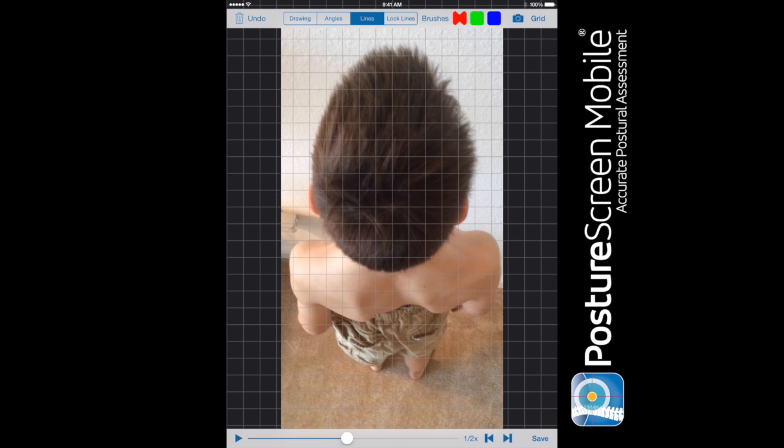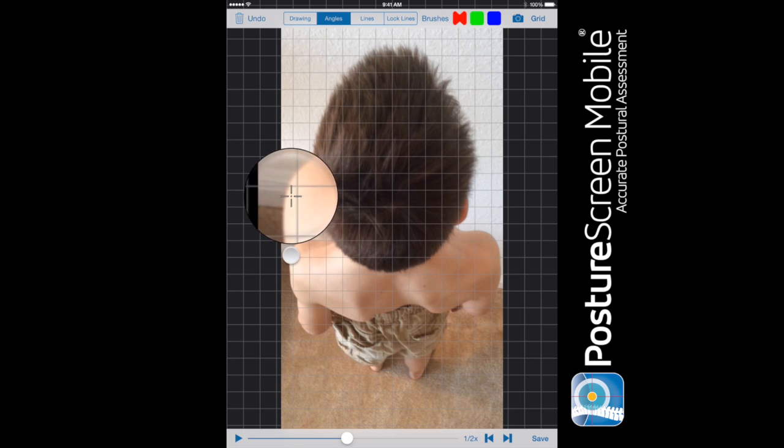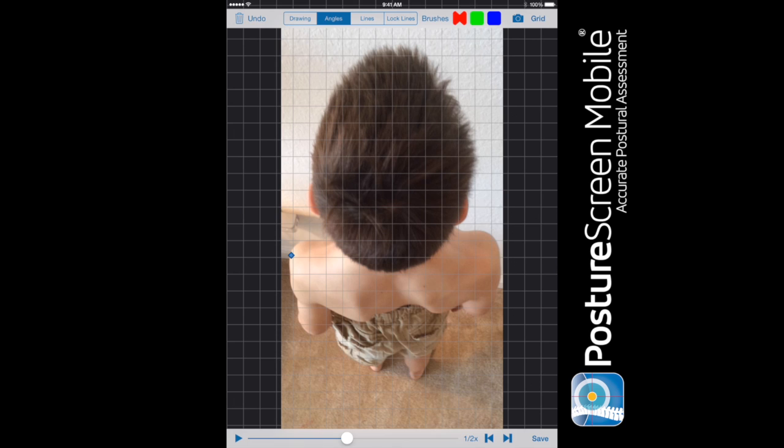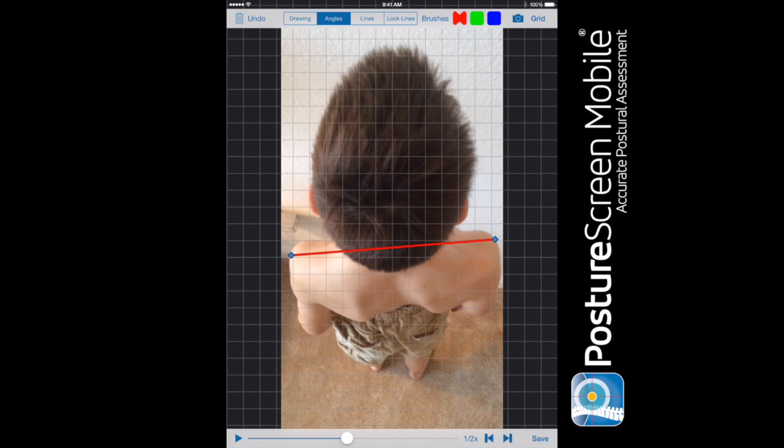And if we wanted to, we could go ahead and erase lines. And if we wanted to do angles, we could use the angle tool as well. So like if I was going to use the angle tool on, let's just say the shoulders, I'll just show you this. So basically we would find the shoulder and then what we would do is find the other point here.